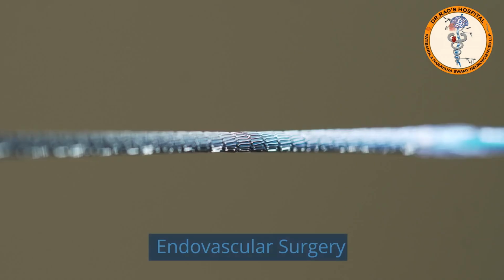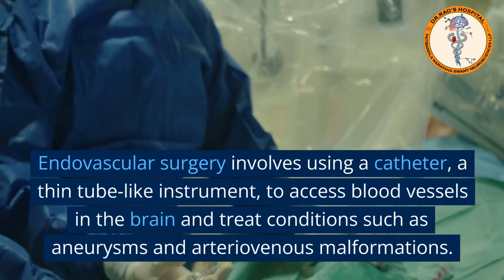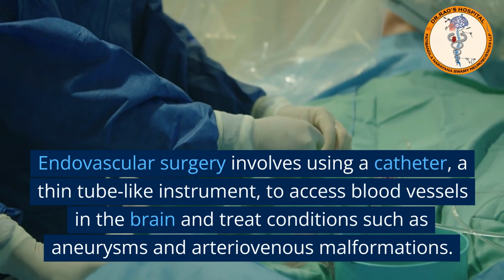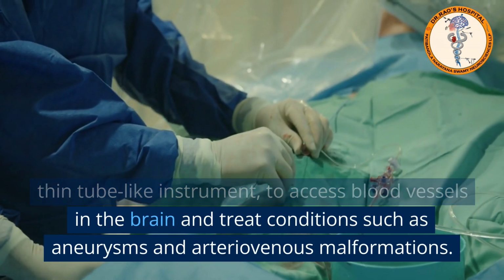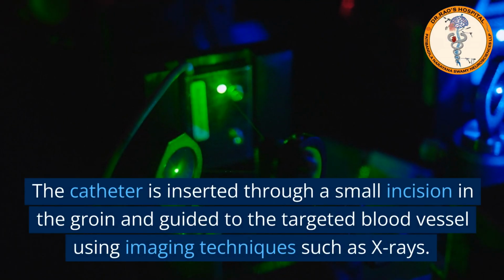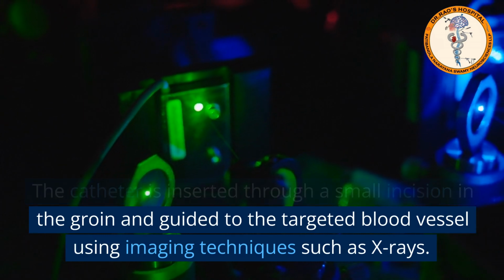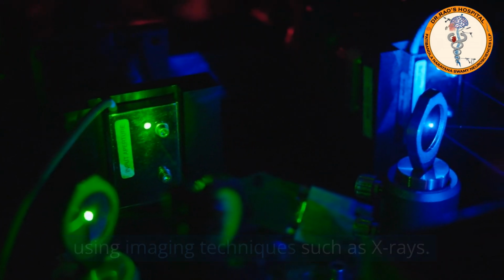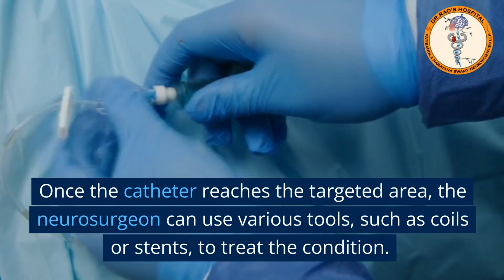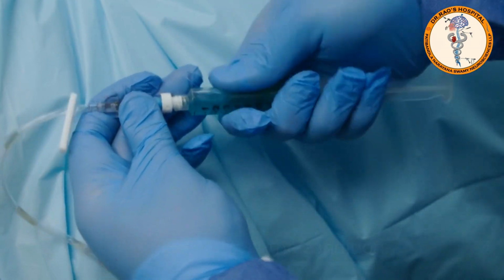Endovascular surgery. Endovascular surgery involves using a catheter, a thin tube-like instrument, to access blood vessels in the brain and treat conditions such as aneurysms and arteriovenous malformations. The catheter is inserted through a small incision in the groin and guided to the targeted blood vessel using imaging techniques such as X-rays. Once the catheter reaches the targeted area, the neurosurgeon can use various tools, such as coils or stents, to treat the condition.